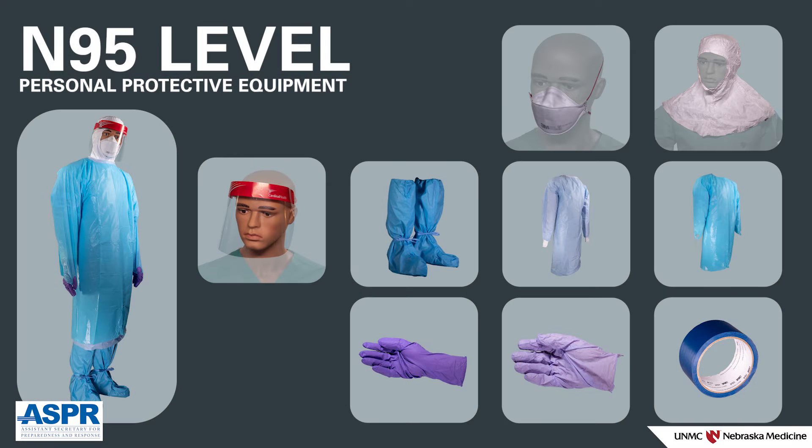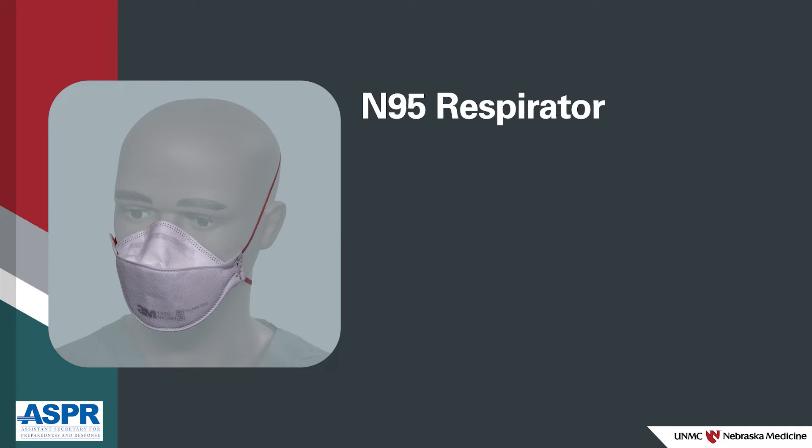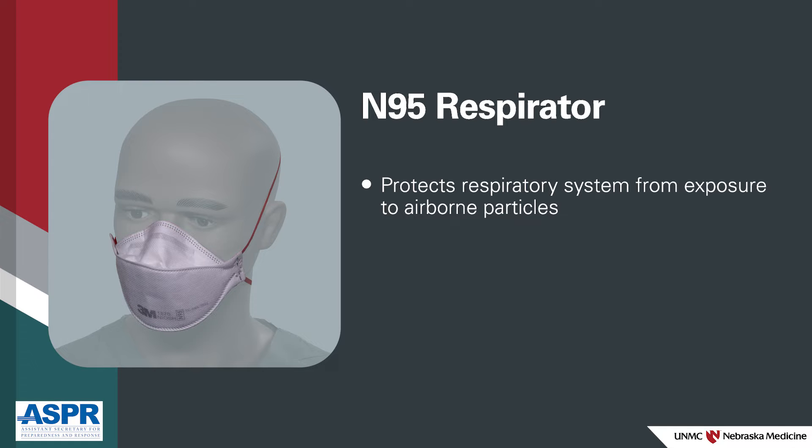You will need the following equipment. N95 respirator — when used correctly, the N95 respirator will protect you from exposure to airborne particles.